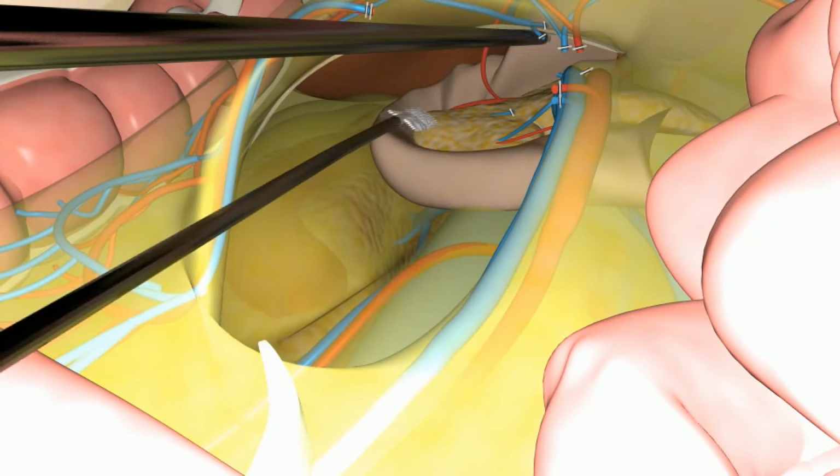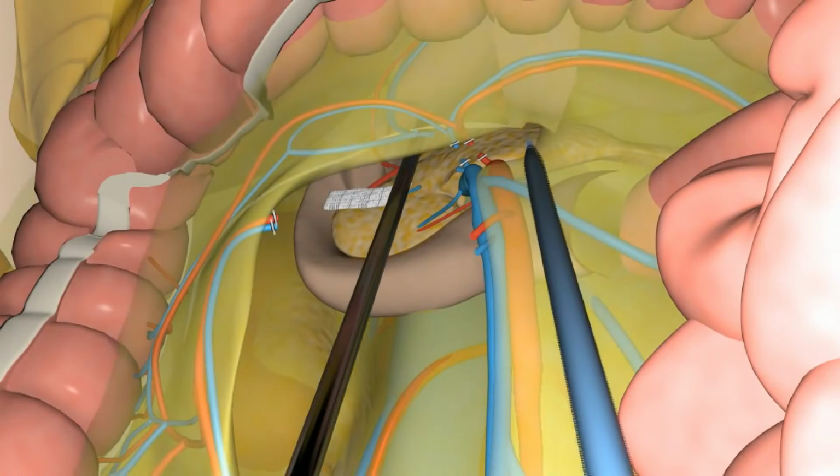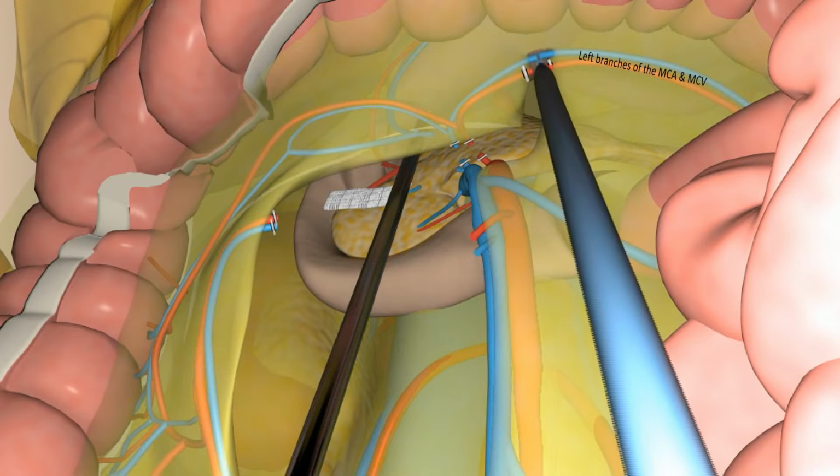A gauze is placed over the pancreas. This facilitates the dissection from above. The left branch of the middle colic artery is clipped and transected.